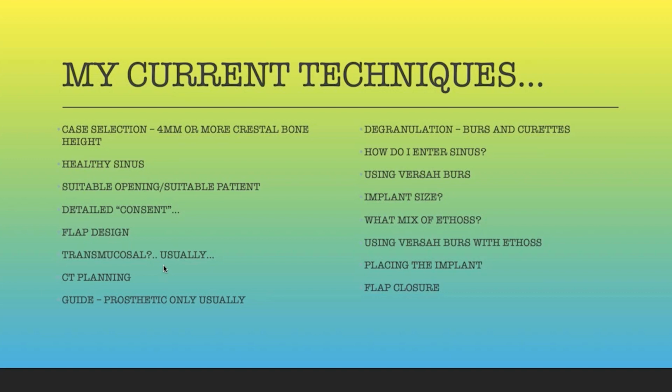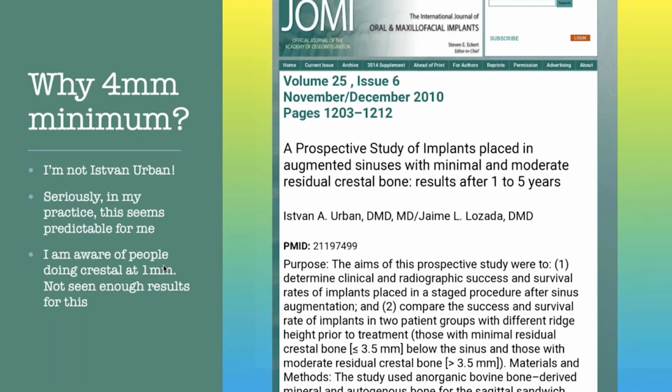Teflon, PTFE, it's very slippy, so therefore you'll tend not to get ingress of bacteria into your wound. I think that's important when you're doing any grafting technique. The second thing is, being so slippy, I think you have to be a little bit careful when you're actually putting those sutures in, that you tie them off properly.